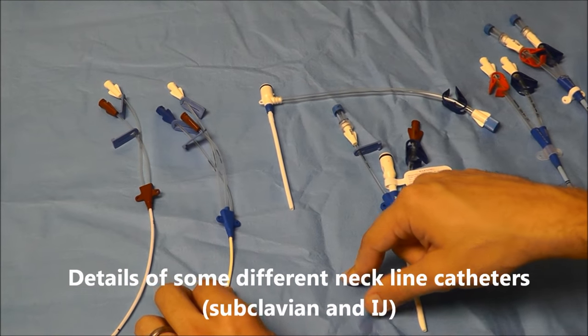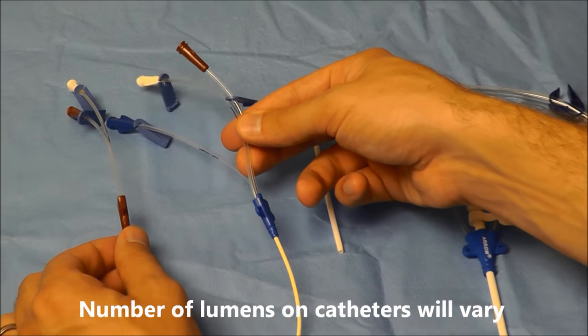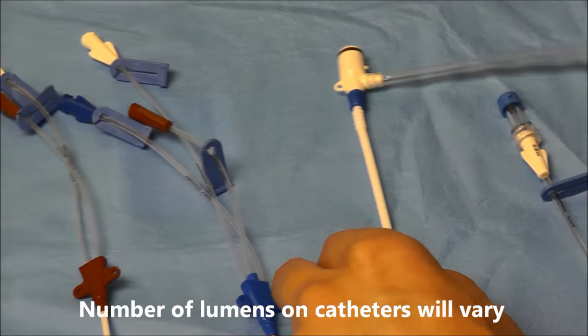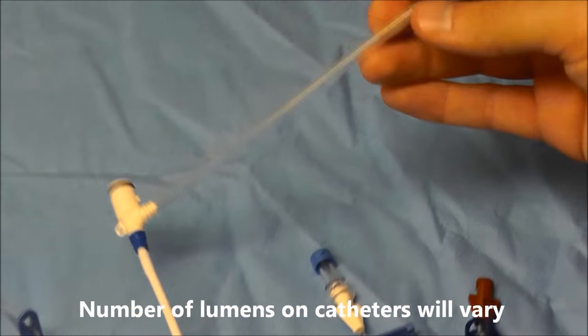Some central line catheters have multiple lumens that you can see here, while some of them just have one lumen.